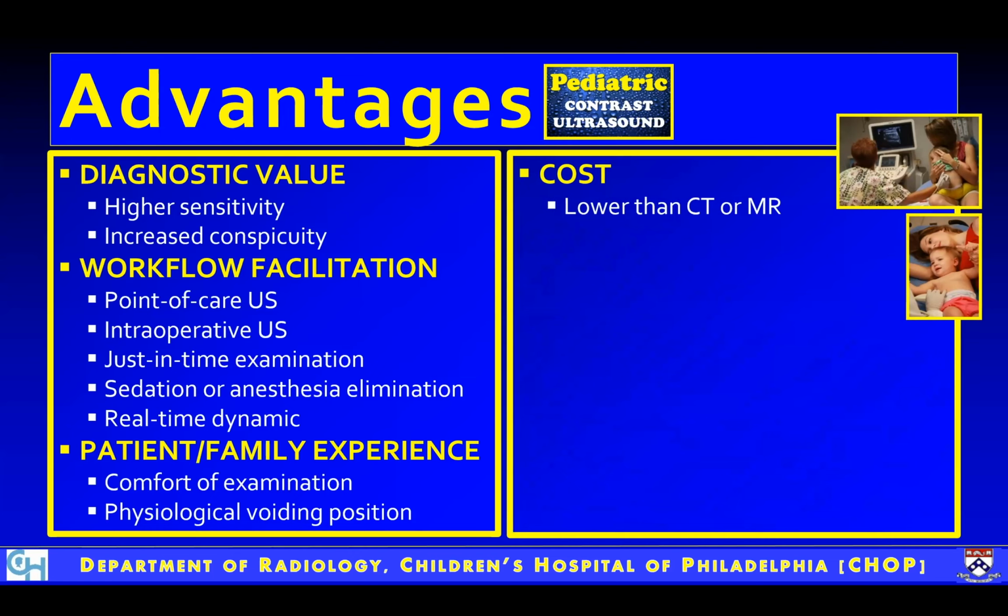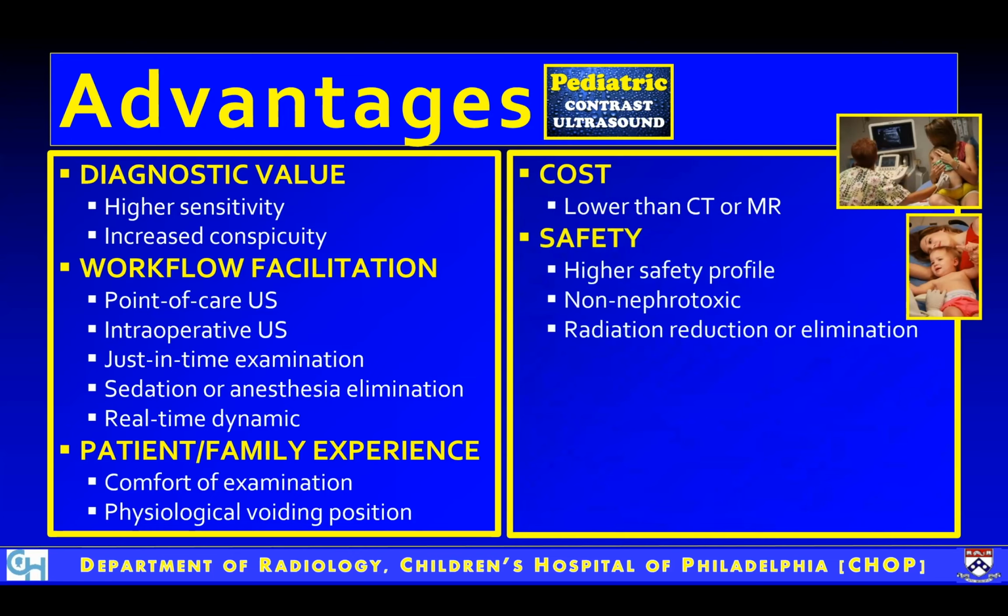The cost can be lower than CT or MR. Contrast ultrasound has high safety profile. It's non-nephrotoxic and avoids the use of radiation, or completely lowers the amount or eliminates the use of radiation, which is important in a growing child.